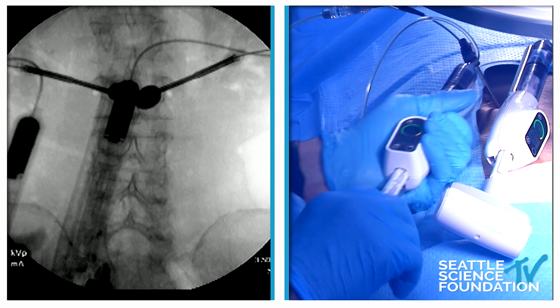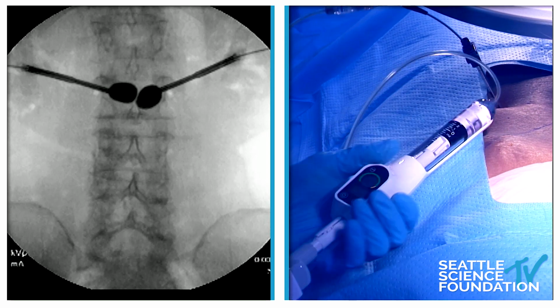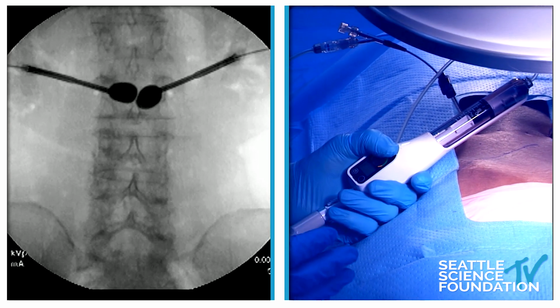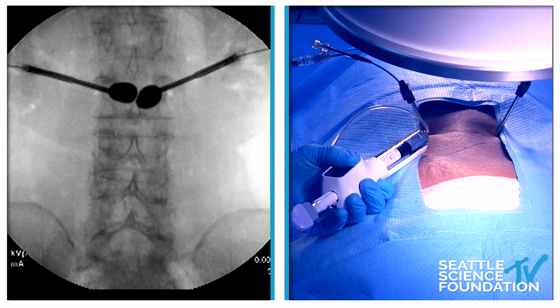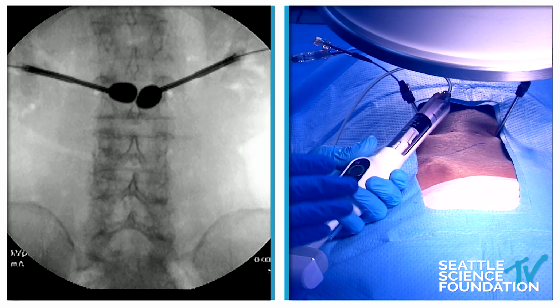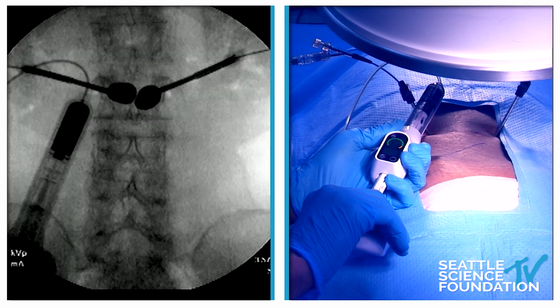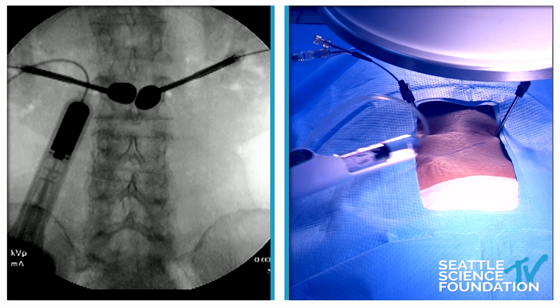So the maximum balloon inflation is, you're at the point where, number one, you've corrected the fracture, you've accomplished that goal. Number two, the balloons are at their maximum inflation, and these are low compliance balloons, so if you blow them up past whatever volume they will take, they will burst. And if they don't burst, there's no elastic recoil. The patient's insides don't explode. Fluid's not compressible, so you do it by feel. It goes from the pressure that you can see on the gauge and the pressure you can feel in your hand by turning the syringe to loss of pressure. And this is an excellent balloon inflation pattern.